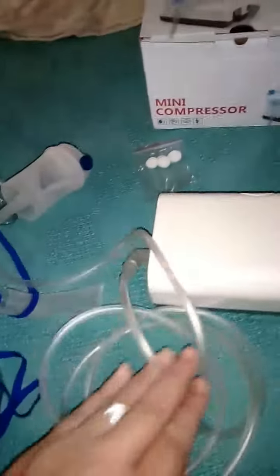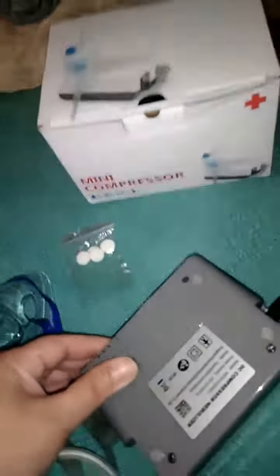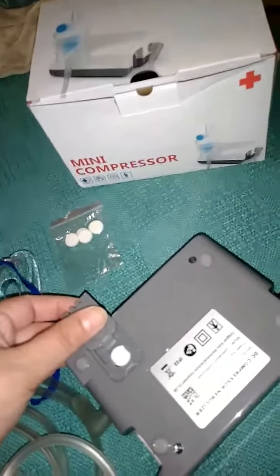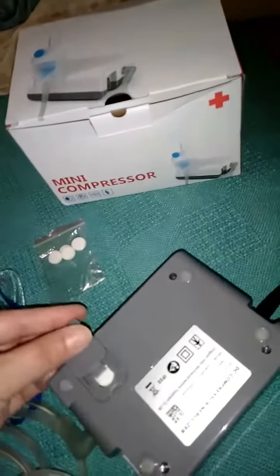It does come with a 12-volt power cord that you plug into the wall. It comes with an air hose and a medicine cup. It also comes with a mouthpiece and two masks, one larger and one smaller. Also extra filters — you turn the component over to the back, right here, this is where your filters go. So once it starts getting dirty, you just replace it with another filter and you'll be good to go.